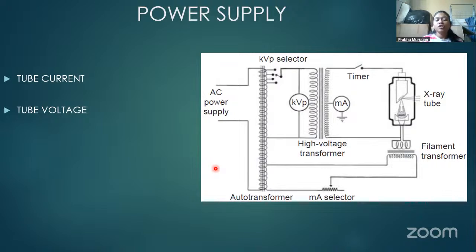Okay, so this tube voltage is measured in the form of kilovoltage potential. The ideal kVp for your IOPA machines, cephalometric and OPG is between 70 to 90, or sometimes between 80 to 120. Not more than that. 70 to 90 or 80 to 120. This is the common reading that has been present.